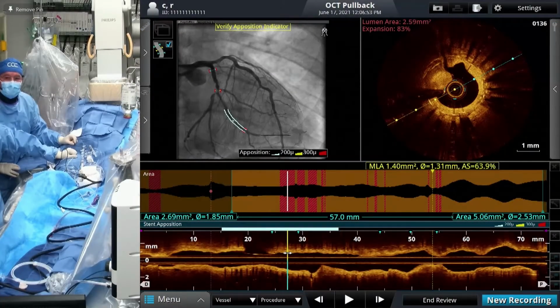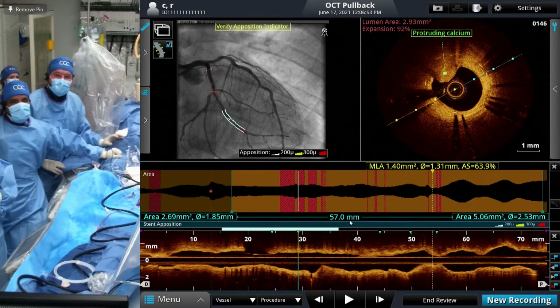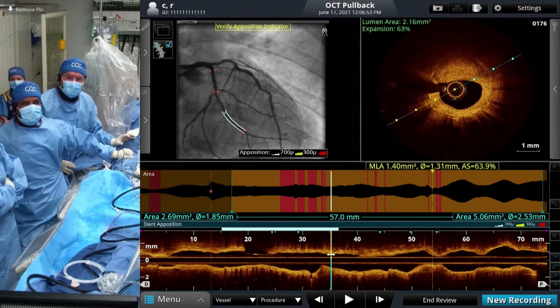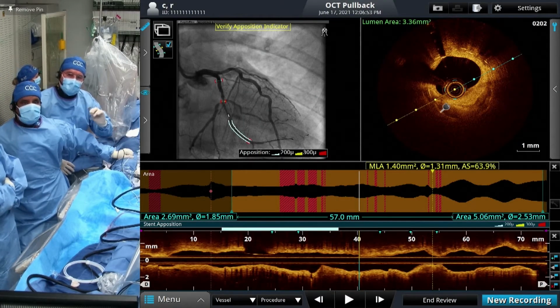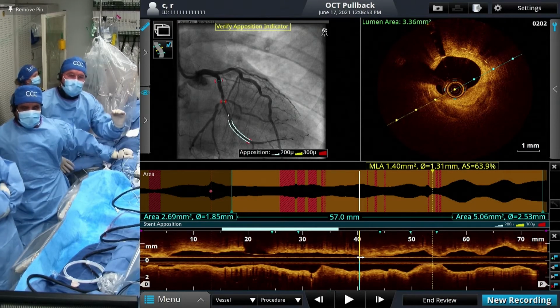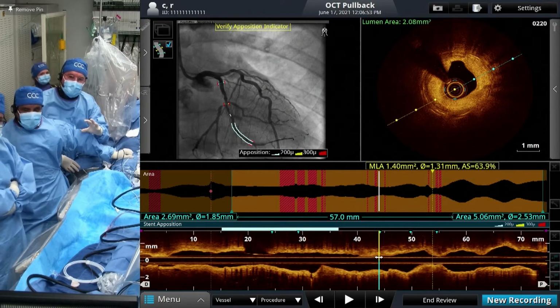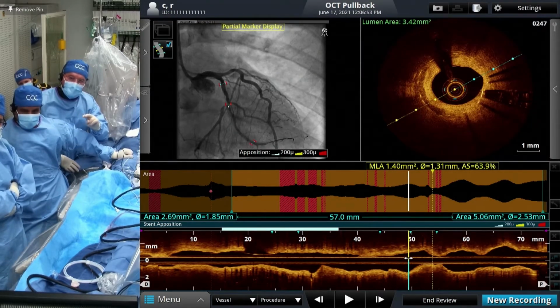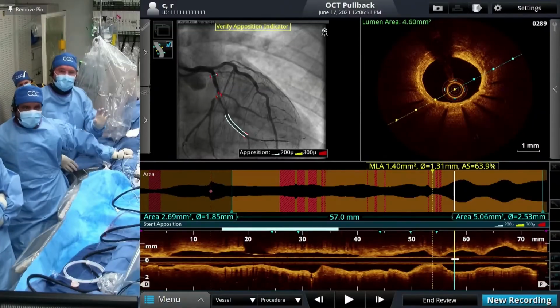Yeah. And then there is an area where you have a nodule, an ISR with a big nodule of neointimal hyperplasia. Just go proximal and then you see the calcium. So over here is neoatherosclerosis, and that's calcium. The refraction is very direct. You can see behind, so that's not lipid. If it was lipid, you wouldn't see anything behind. So here is a lot of calcium in this ISR. A 360-degree calcium there with the double layer, and more proximally you see neointima and a little bit more severe neointimal hyperplasia. So we have trouble with this case.